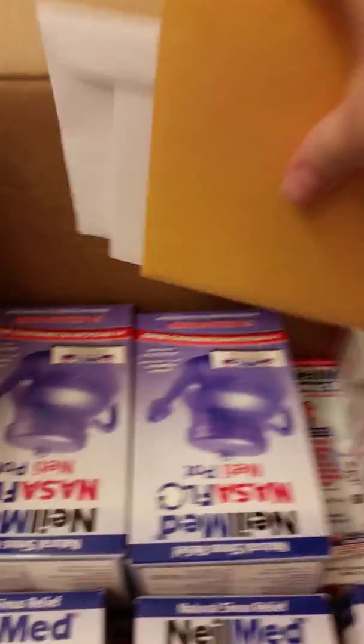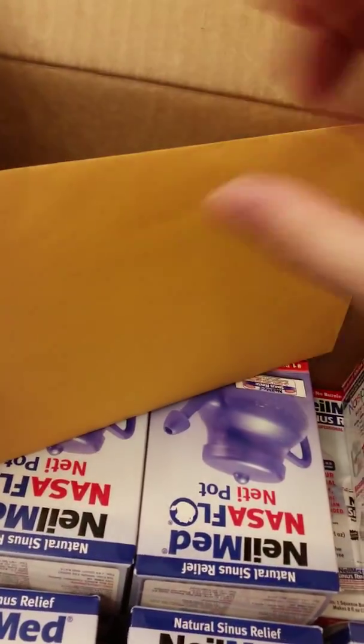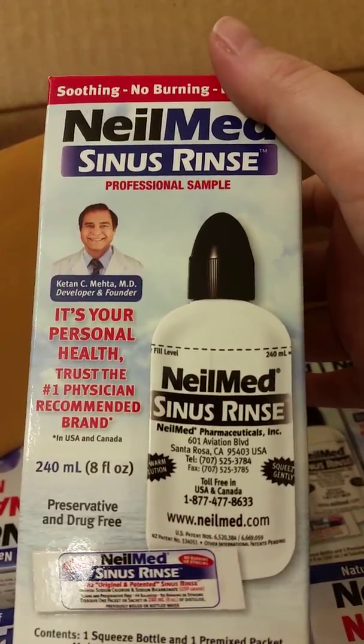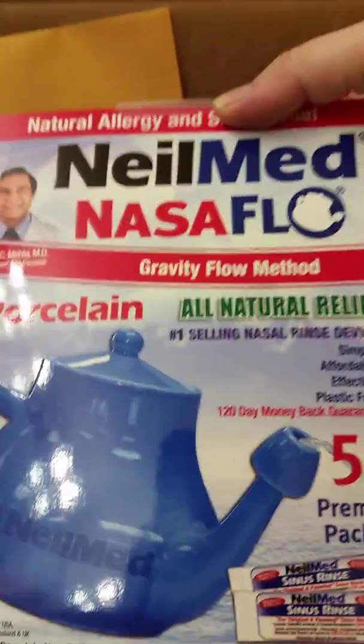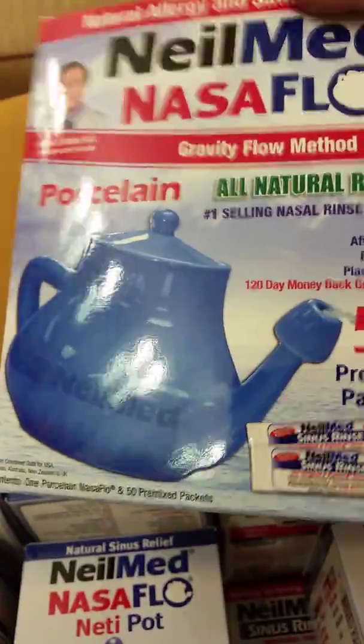I don't know that all my moms will be taking part, but there's plenty here. I believe there's ten of these sinus rinse bottles. And this — this is my gift — it's a porcelain neti pot, it's really hefty.